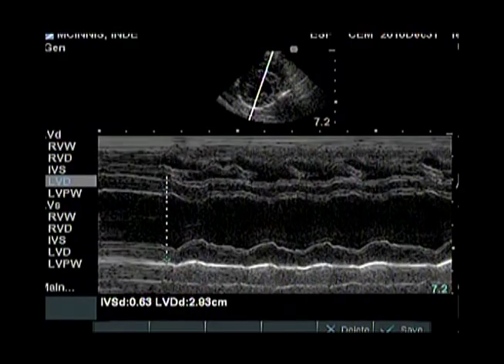Calipers are placed on the endocardium of the left ventricular side of the septum and the endocardium of the left ventricular posterior wall. Do not include papillary muscle of the left ventricle in your measurement. If left ventricular papillary muscle is present, try to identify and follow the most persistent hyperechoic line of the endocardium to the point you choose to measure.